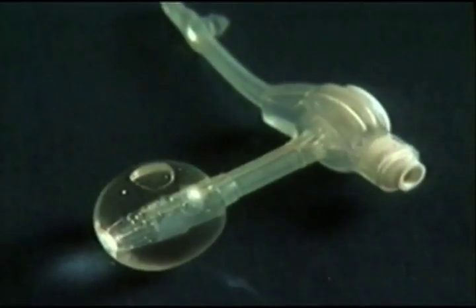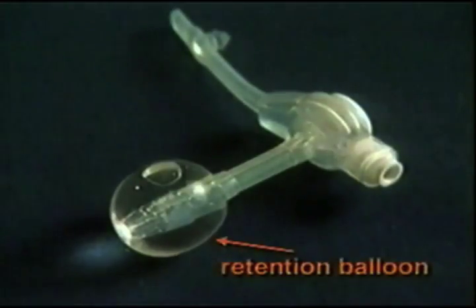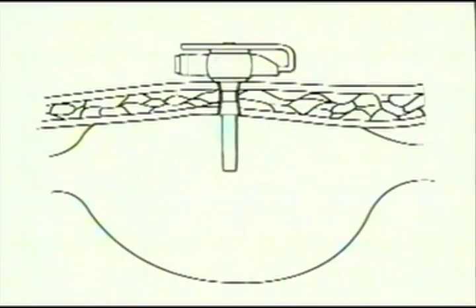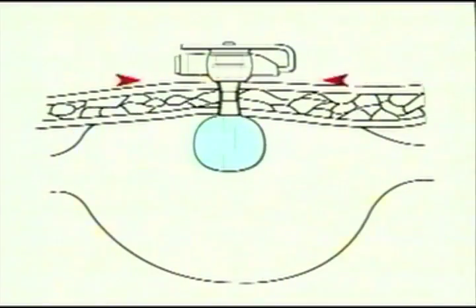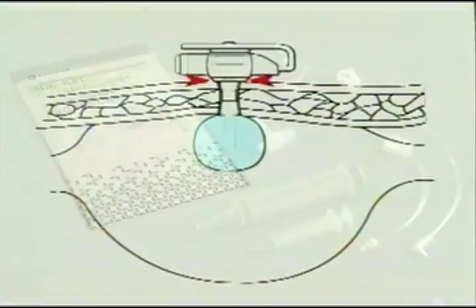Another special feature of the Mickey feeding tube is this little balloon called the retention balloon. It also holds the Mickey tube in place within the stomach and secure in the stoma tract. The balloon inflation port is used to inflate the balloon. When the balloon is inflated to the proper size, the external portion of the Mickey feeding tube should float just above the skin, with a space about the thickness of a dime.